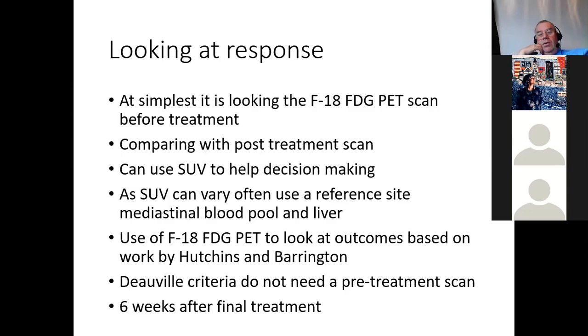In the UK now, we try to ensure that there's always a pre-therapy scan, but that may not be possible in areas where access to PET is limited, in rural areas, for example. The other thing is we want to avoid FDG uptake in inflammatory tissue, so we try to do the post-therapy scan 6 weeks after the final treatment.